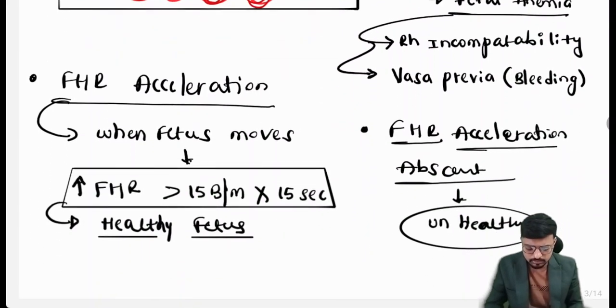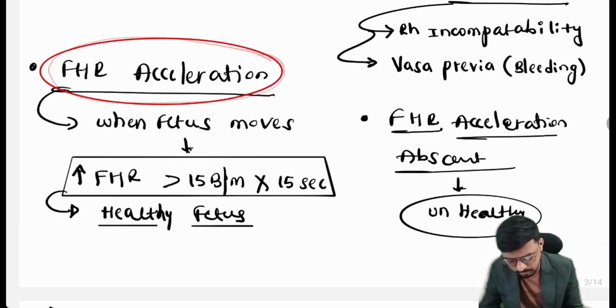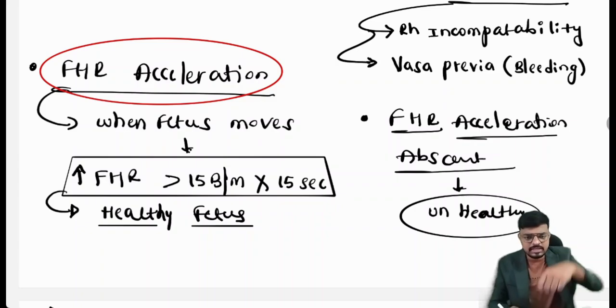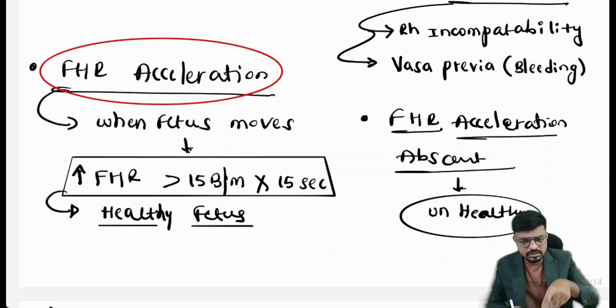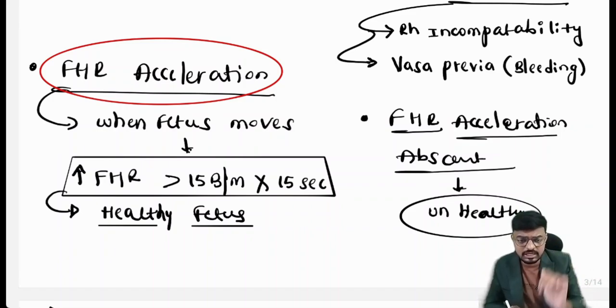Next we come to the fetal heart rate acceleration, a very important component of the NST. What does it mean? Acceleration means, like accelerating a bike, you increase the race of the bike. Something is increasing, that is the acceleration. Deceleration means you are releasing the race, something is decreasing, that is the deceleration.